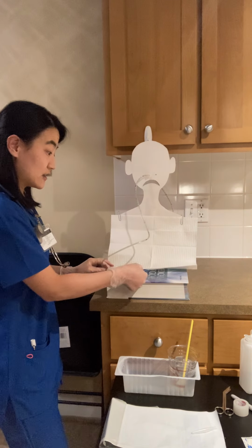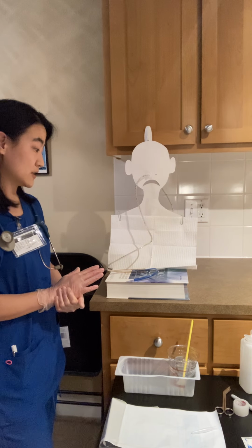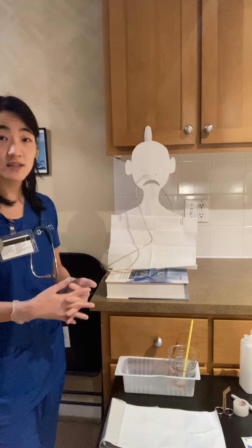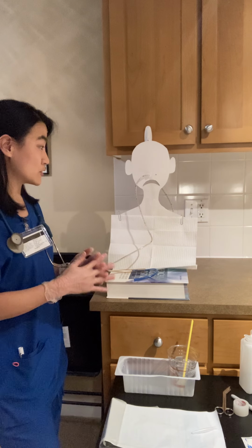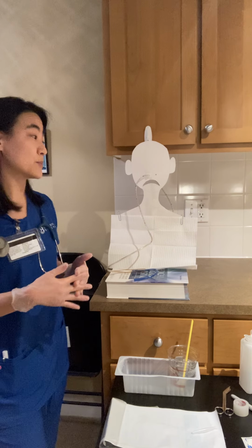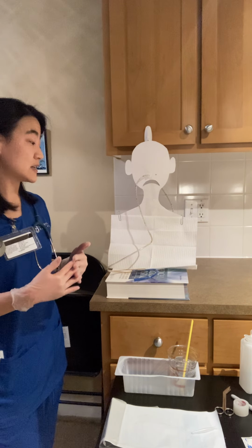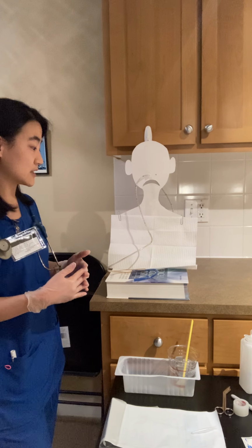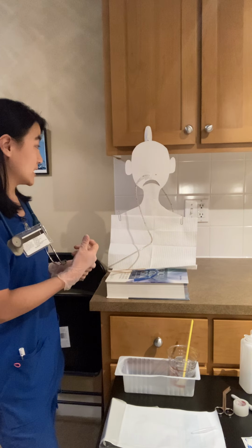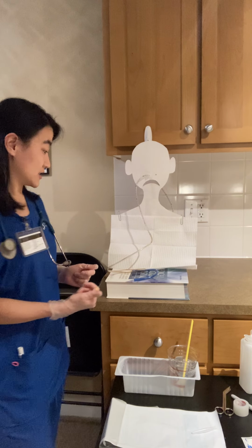Alright, and even after completing those 3 assessments, I'm going to want to use the gold standard of the facility and request that a chest x-ray be done to just confirm the placement of the gastric tube in the stomach and not the lungs, and that is especially true if anything is going to be going into the nasogastric tube and not just out.